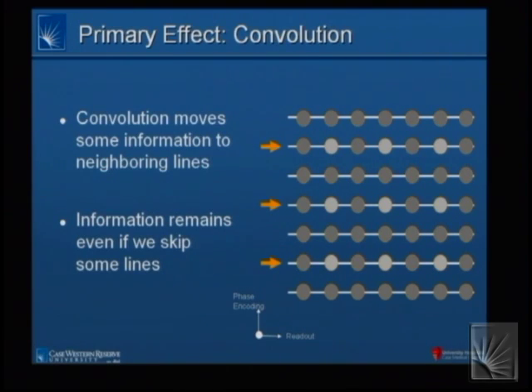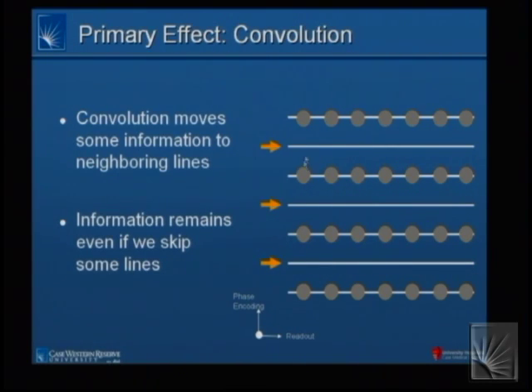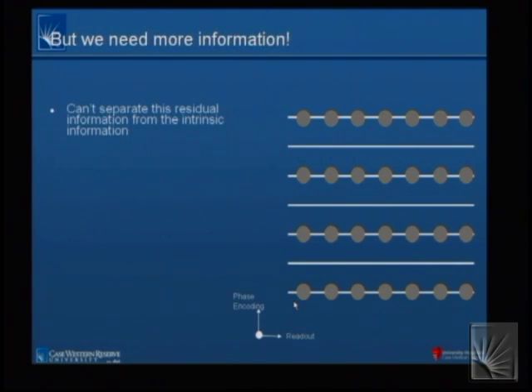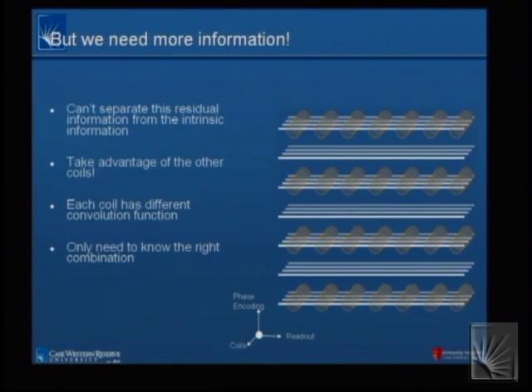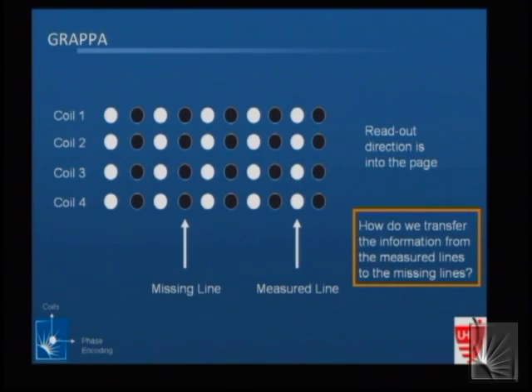So in this particular case, the convolution moves information all around K-space, whether I have data in those lines or not. For example, maybe I didn't collect this line or this one or this one. There was still a blurring associated with that coil from this location to this one and vice versa. But I can also add multiple coils, or the fact that there are multiple coils there, and therefore fit a relationship across the different data that I see.